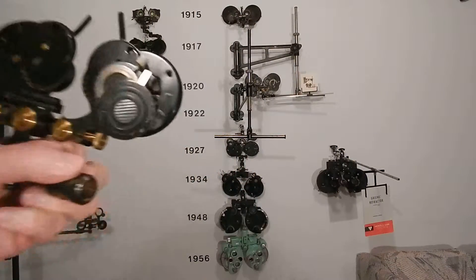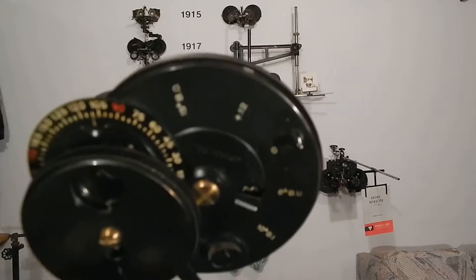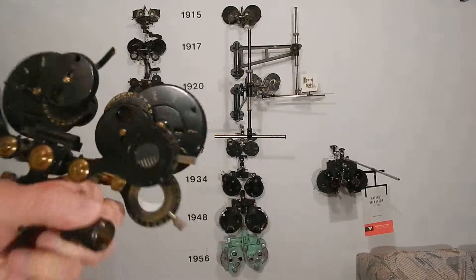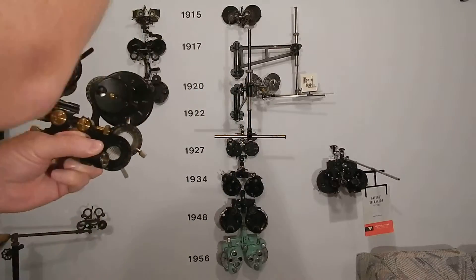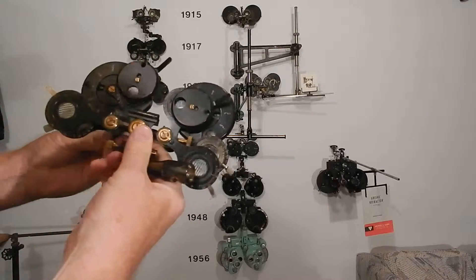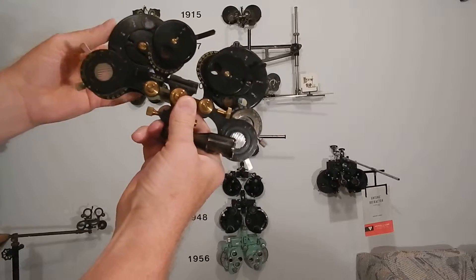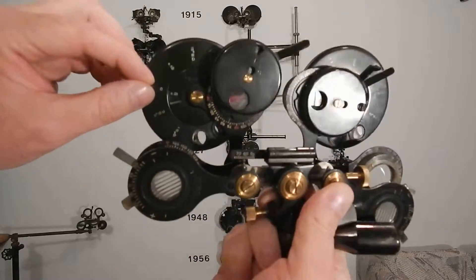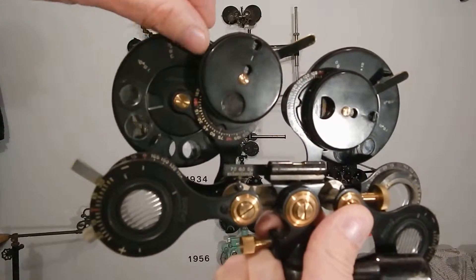You can see written right on it — if it's close enough — it says 'Phoropter' right on it. This is entirely different. The lenses are tiny — instead of being one inch or three-quarters of an inch, these are like camera lenses. This is so well made — this is the first phoropter.